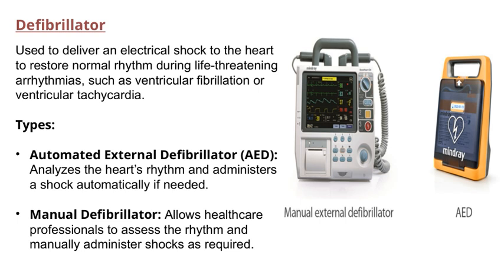Now, there are different types of defibrillators. One common type is the automated external defibrillator, or AED. These devices are designed to analyze the heart's rhythm automatically and then deliver a shock if it detects a dangerous pattern. They're user-friendly and often used by first responders and even by laypeople trained to assist in emergencies.